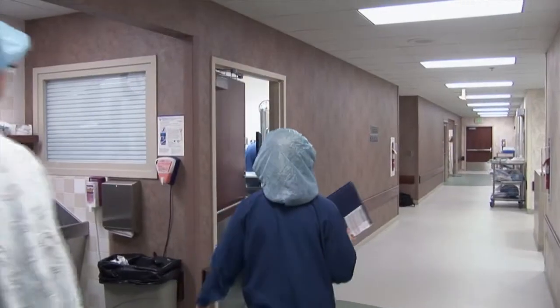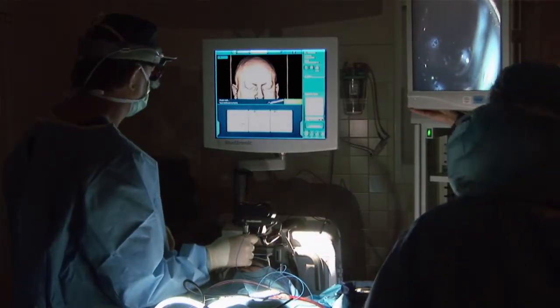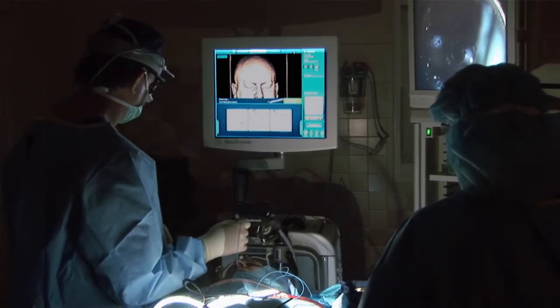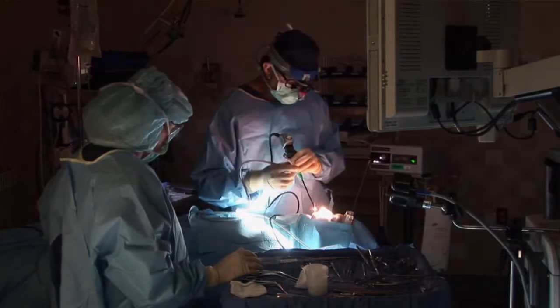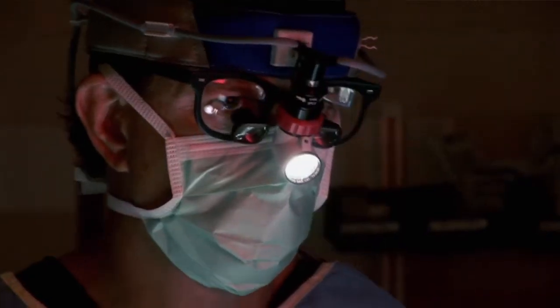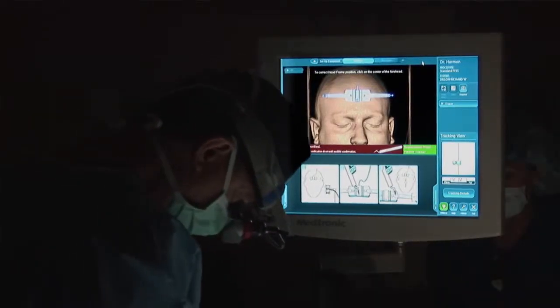Well, basically how I explain it to patients is it's a device that I can use in surgery, and it's basically a GPS for inside your head. Through the use of a special CT scan and a computer, we can reference that to you in the operating room. I can take an instrument, put it inside your nose, and within a millimeter of accuracy I can know exactly where that instrument is through the entire procedure. And because of the tight confines of sinus surgery between the brain and the eye, that gives us the ability to do a better job and a safer job of taking care of what needs to be taken care of inside your nose.